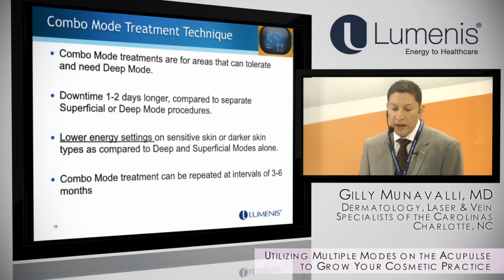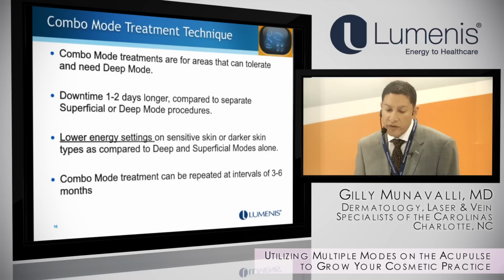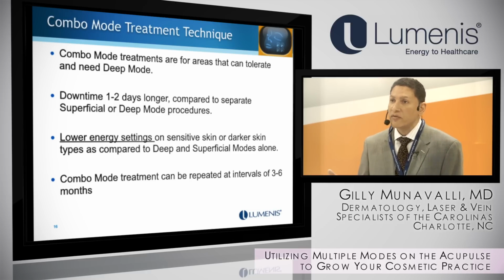More details on that. The downtime for this is typically a little bit longer if you're in the combo mode, because you're using the deep as well. So I typically tell patients about 5 to 7 days, and I try to do their treatments in one sitting if I can. If I can get a little bit more aggressive, I'll do that. But when I have them come back for a second treatment, it's not for several months, because they get benefit from the CO2 for several months after that.